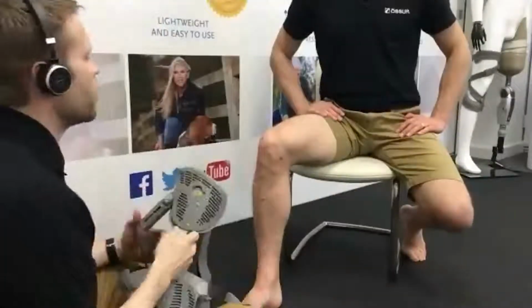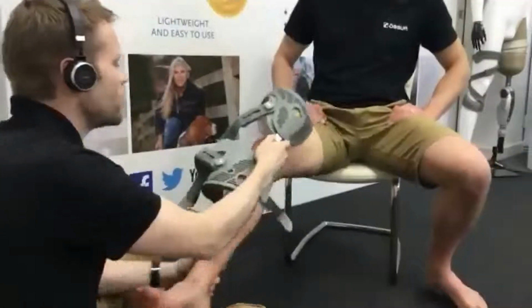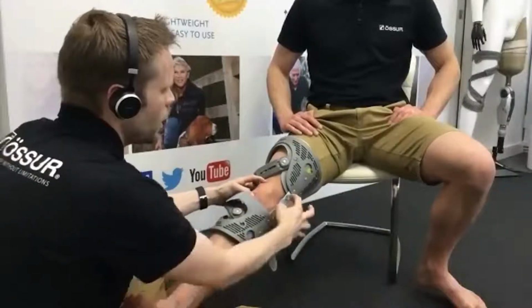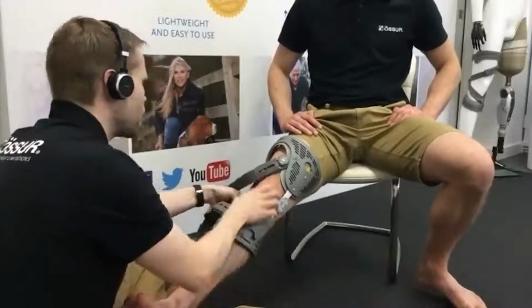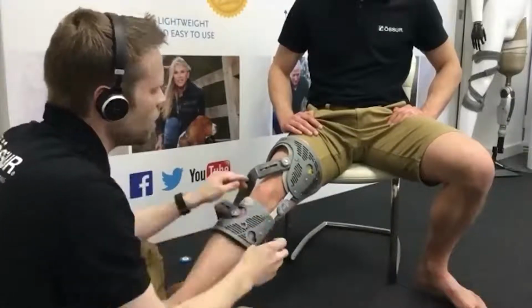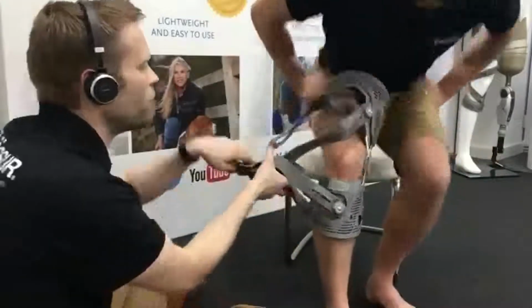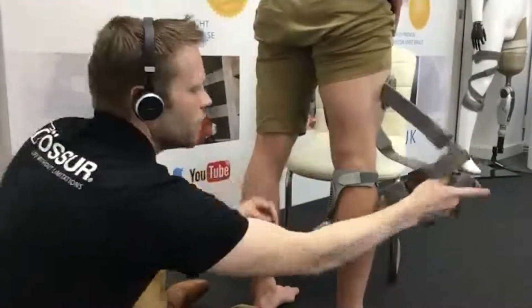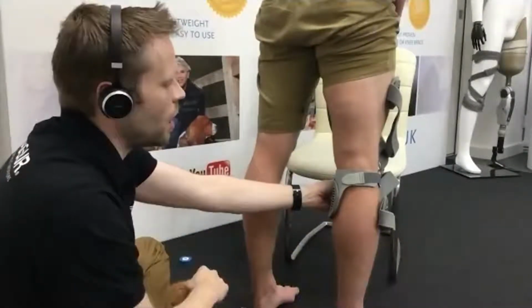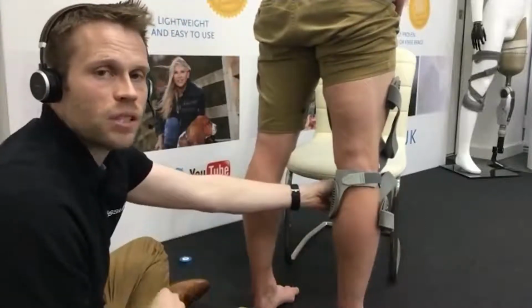So you can see when you actually come to fit this one, we're placing this onto the leg, starting with the leg straight. Bringing this into position exactly the same as we would before, hinge in line with the kneecap, halfway between the front and the back of the knee. And we're just fastening this gastroc strap as part of the AMS wrap either side. So you can see if I hold these out of the way, and if Pete was to stand up, it fully anchors the whole brace in position and keeps it there. So it just means we're anchoring on top of the calf in order to maintain suspension.